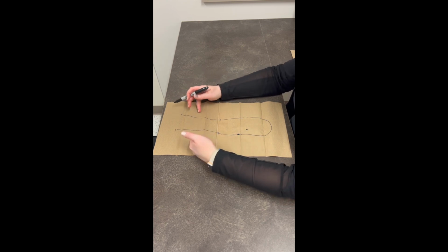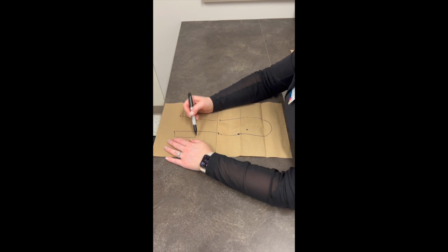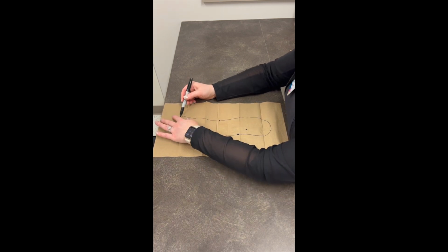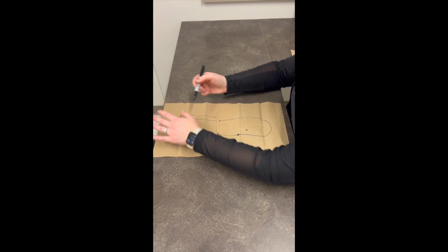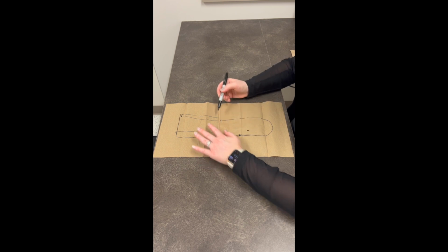So now on the forearm portion, I'm going to extend this out so it's halfway up on the forearm. So I'll just tack on some material. And extend that up.